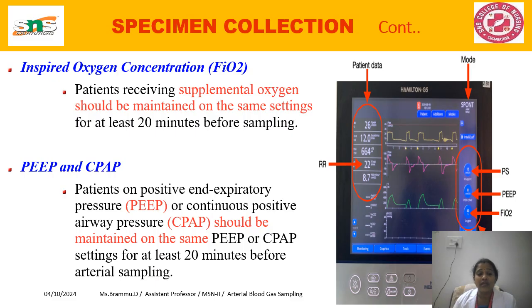That's the reason why always maintain the same FiO2 levels at least 20 minutes before the sampling is done.